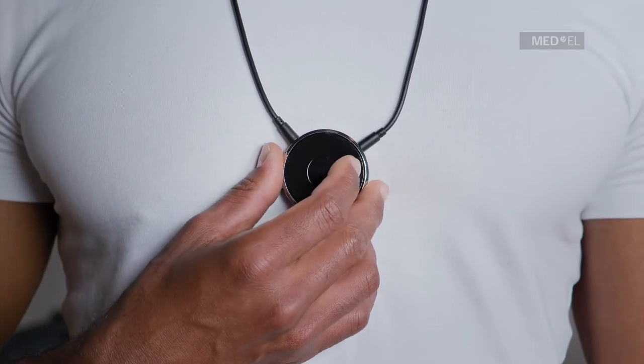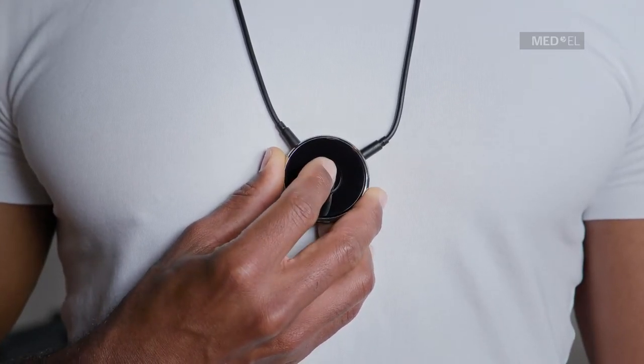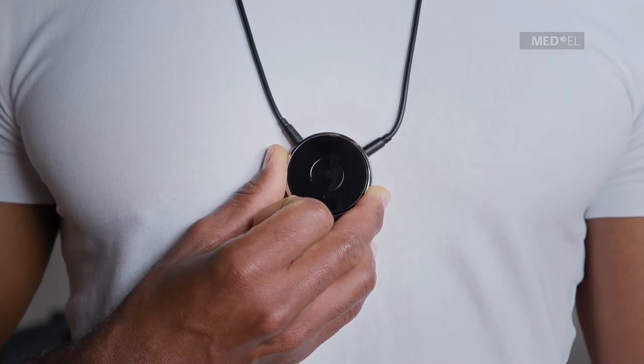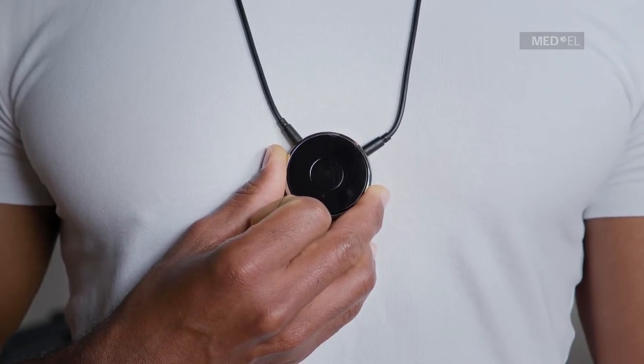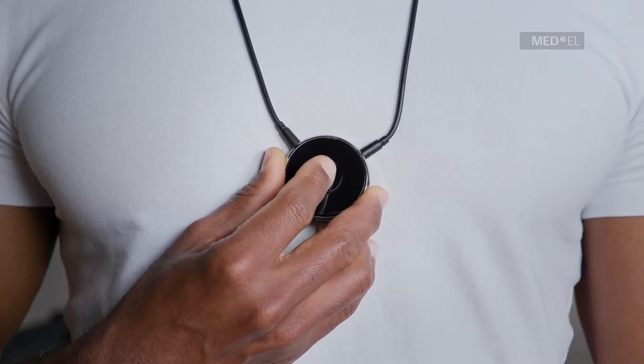If you receive a call, the ringtone will be streamed to your audio processor and the blue LED will flash. Briefly press the multifunction button to accept the call. To reject the call, press and hold the multifunction button for more than two seconds.